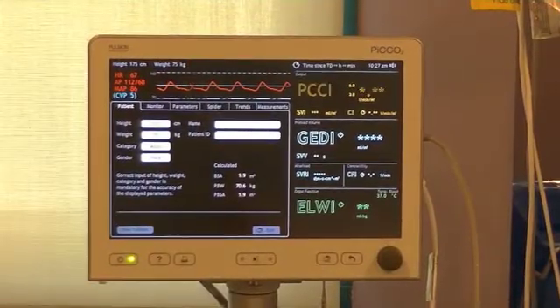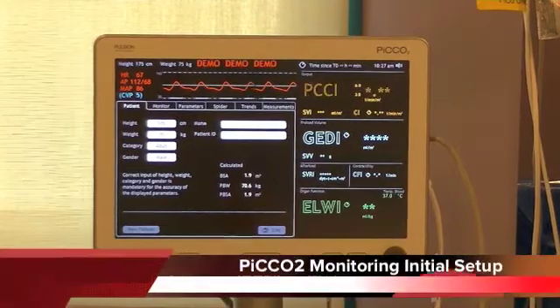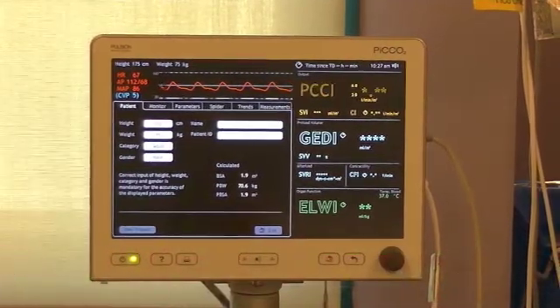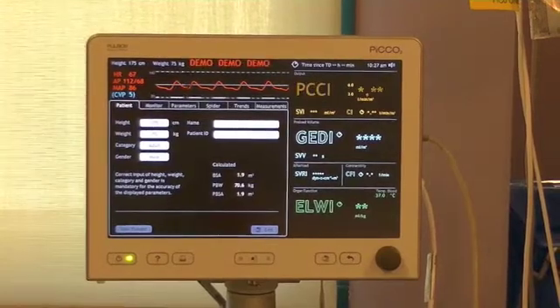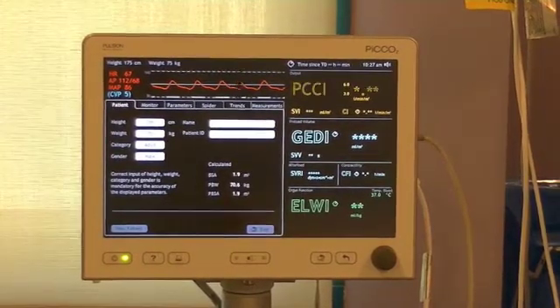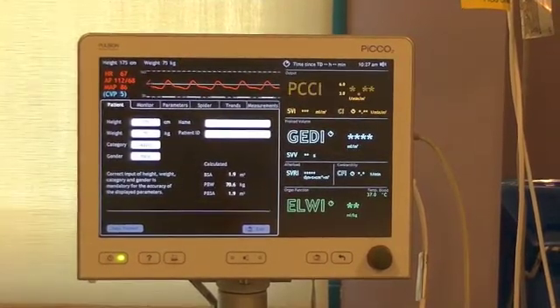This presentation will show you the basic preparation and setup of the PiCO contour cardiac output monitor, or the PiCO monitor. PiCO is an advanced hemodynamic monitoring system that gives a complete hemodynamic picture without a pulmonary artery catheter.